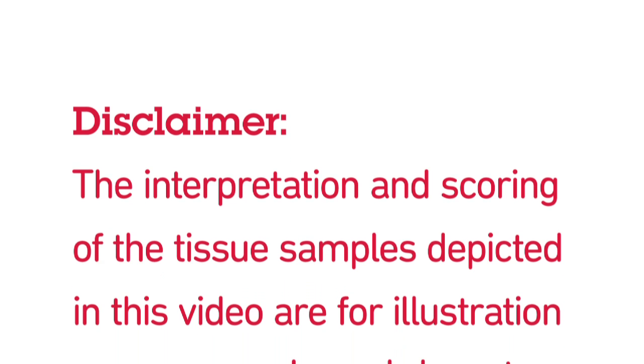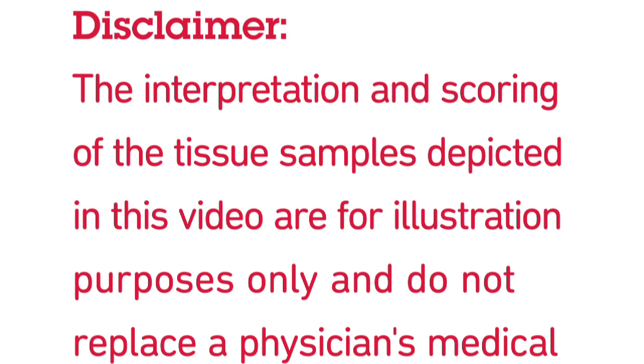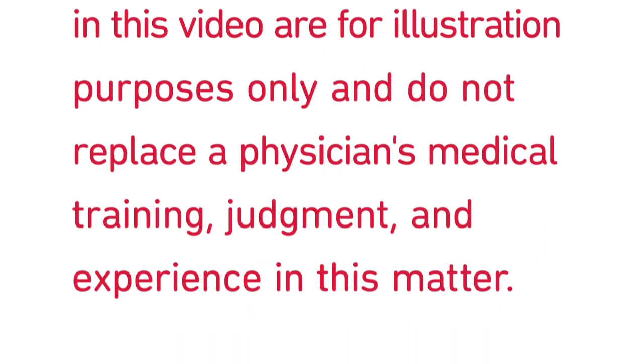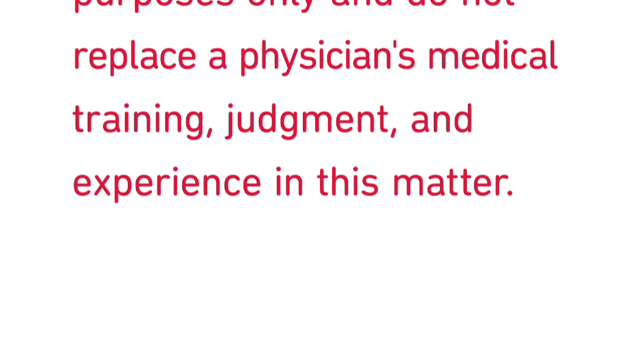The interpretation and scoring of the tissue samples depicted in this video are for illustration purposes only and do not replace a physician's medical training, judgment, and experience in this matter.